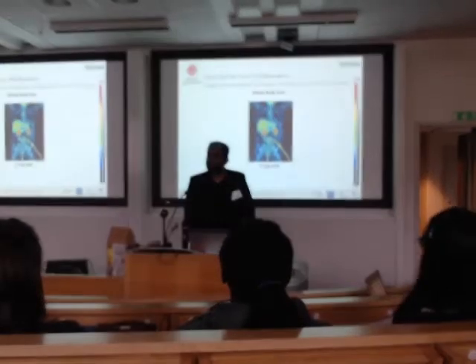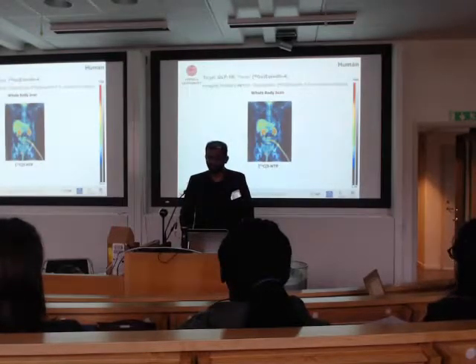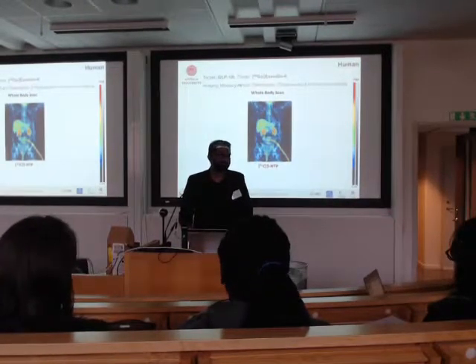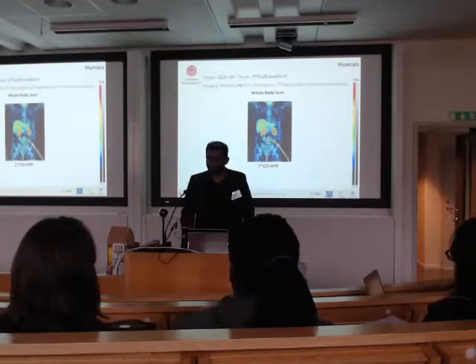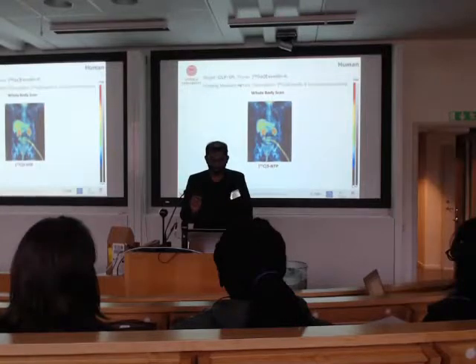Earlier I showed you the mice model, so we tried it on an insulinoma tumor model. But if you remember, Steve Jobs had the same insulinoma tumor. At that point of time, this 5-HTP was a novel sensitive tracer. So what I'm showing you is a compassionate case study. This lady was 35 years old at that point of time. She was diagnosed with insulinoma.